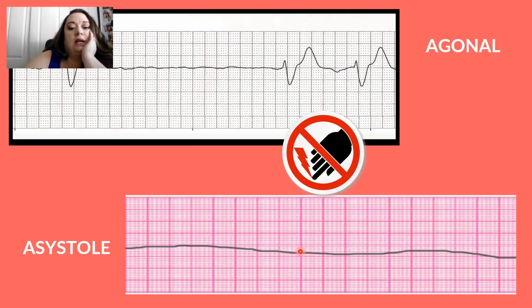And then asystole is not usually a dead straight line, like on Grey's Anatomy. We never shock asystole, by the way. Asystole is your actual flat line. So it actually might take a while for your patient to hit asystole. If you've called time of death, they might still have something going on up here. Any questions so far?